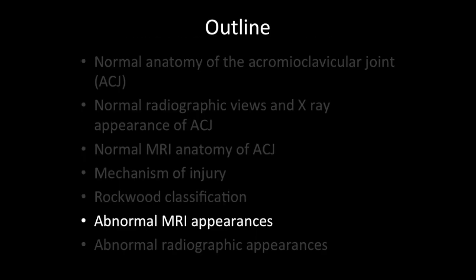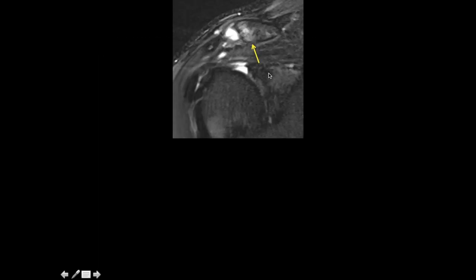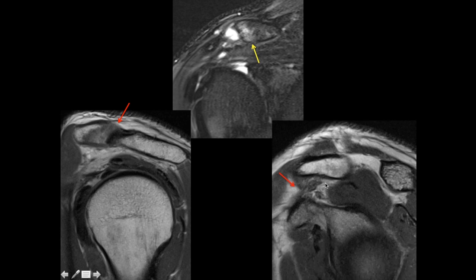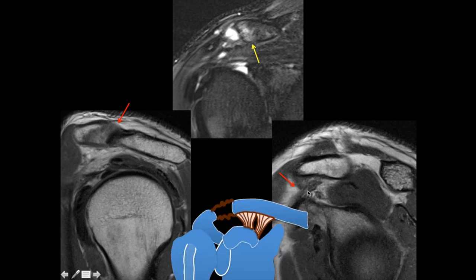In this first abnormal case, there is distal clavicular edema and some edema along the AC ligament, but the ligament does not appear torn. The superior ligament appears more injured or sprained than the inferior one. On the sagittal image the coracoclavicular ligament is intact — you can even appreciate the fat between the two components. This is a sprained AC ligament with an intact CC ligament: Type 1.